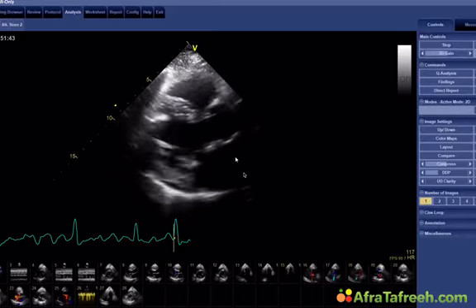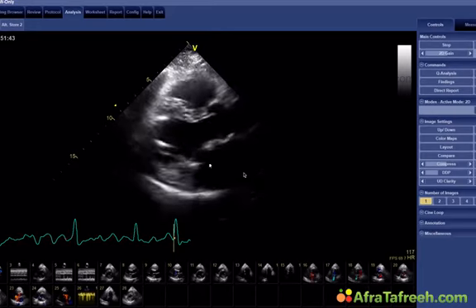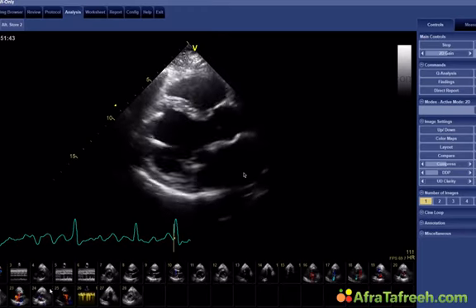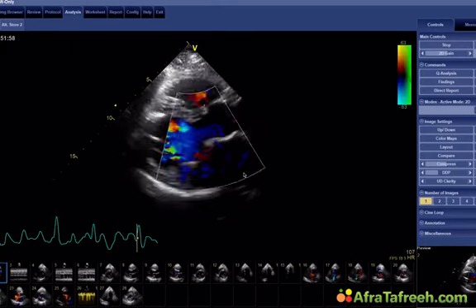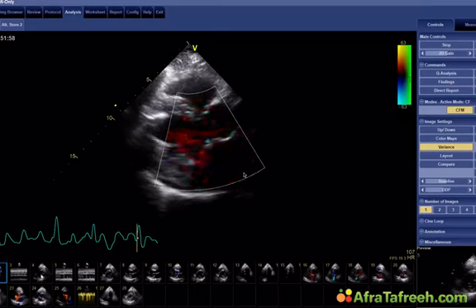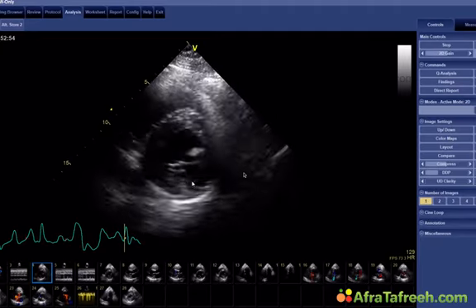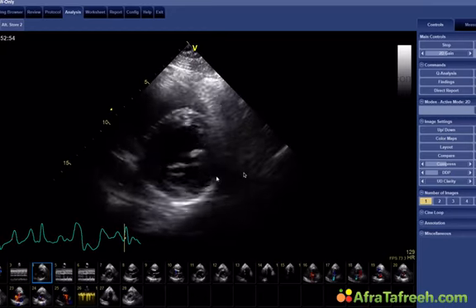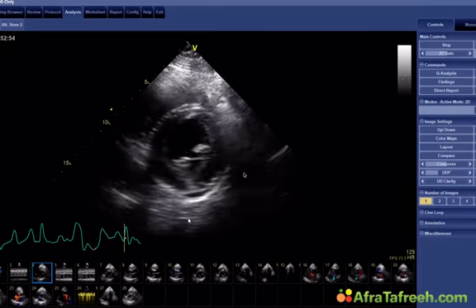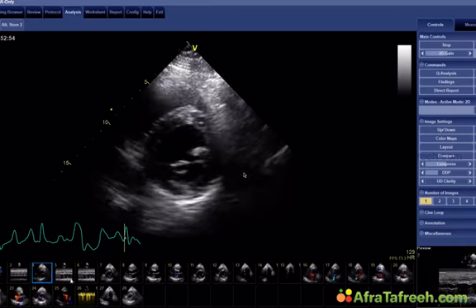right after surgery. Okay, first of all, the patient has a bit of dysynchrony. This is the mitral annular ring that was put in place. This is the anterior leaflet and the posterior leaflet. Okay, and now this looked fairly okay at this point. Left ventricular function is not so good. He had atrial fibrillation at the time, so I first thought, well, maybe it's simply because he now has atrial fibrillation. That is why he's not improving the way I would like him to. He had a small pericardial effusion right here in the inferior part.